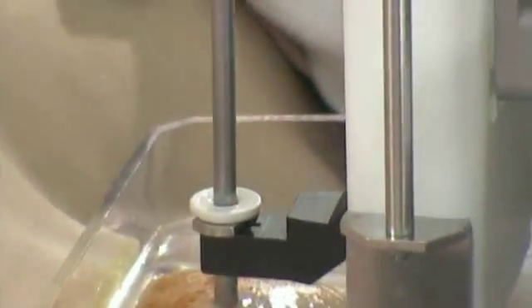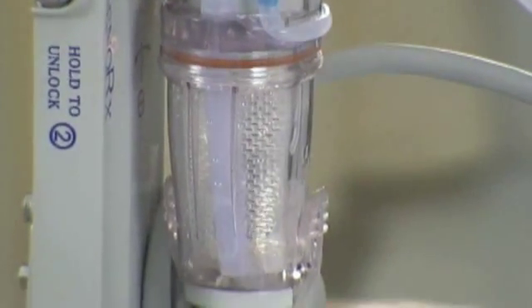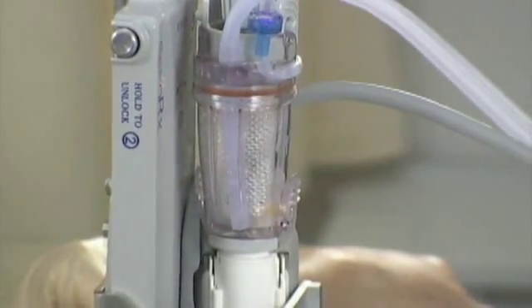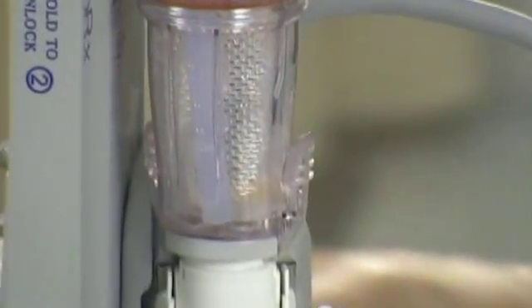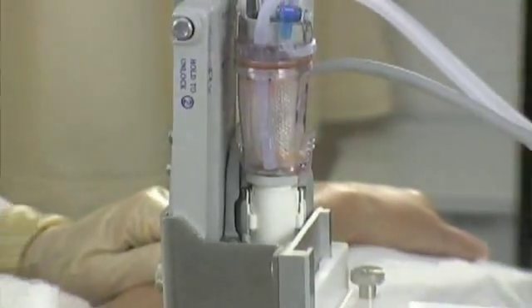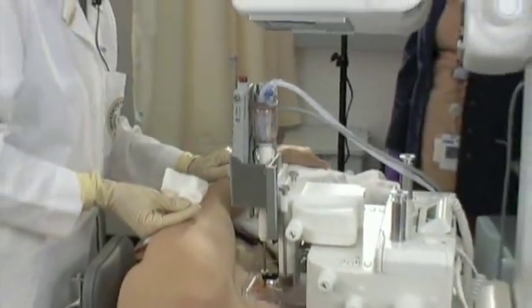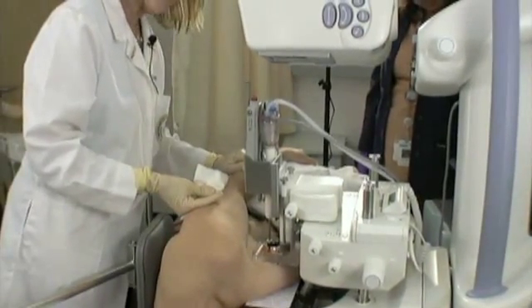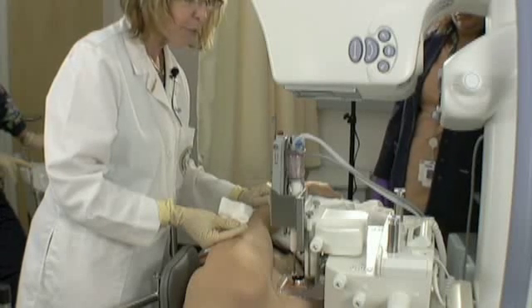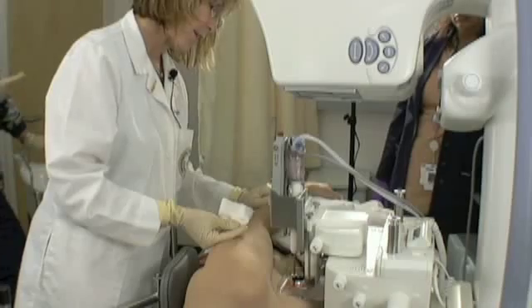It's important when you start sampling to look into your chamber to make sure you're actually getting samples shooting back into the chamber. We're getting beautiful samples. We won't know if we have calcifications in any of the samples until we actually x-ray them. Initially the needle goes around the even numbers — starting at 12, then 2, 4, 6, 8, and 10. The second time it goes around the odd numbers. We actually sample every clock position, taking 12 samples as a standard case.